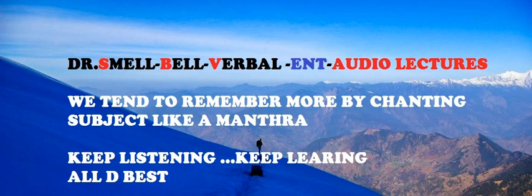Initially use the cutting burr. Once the chorda tympani is identified or blood vessels are seen running along the nerve, change over to the diamond burr to avoid injury to the nerve. So ridge drilling is done. The ridge is a vertical part. Drilling is done parallel to the facial nerve.